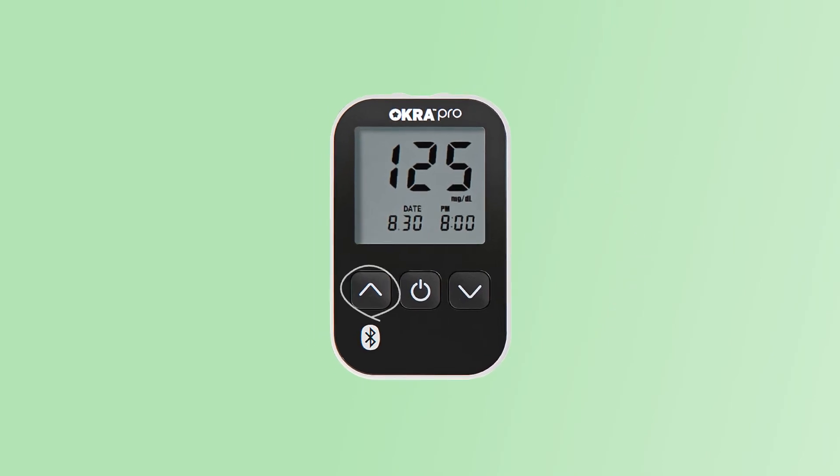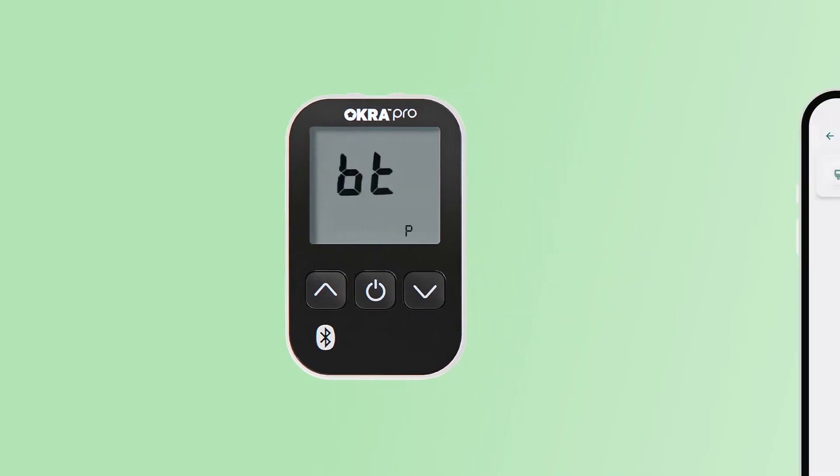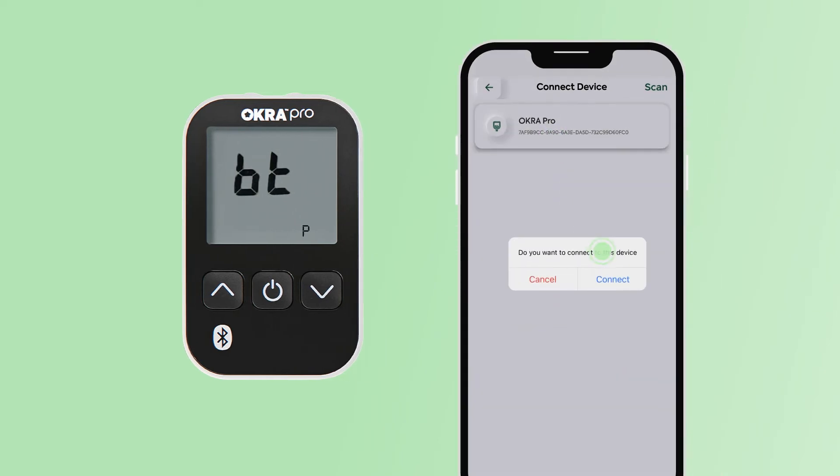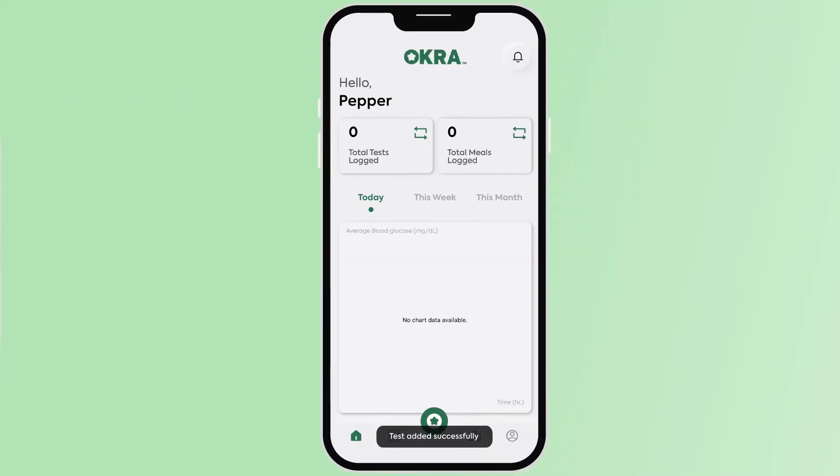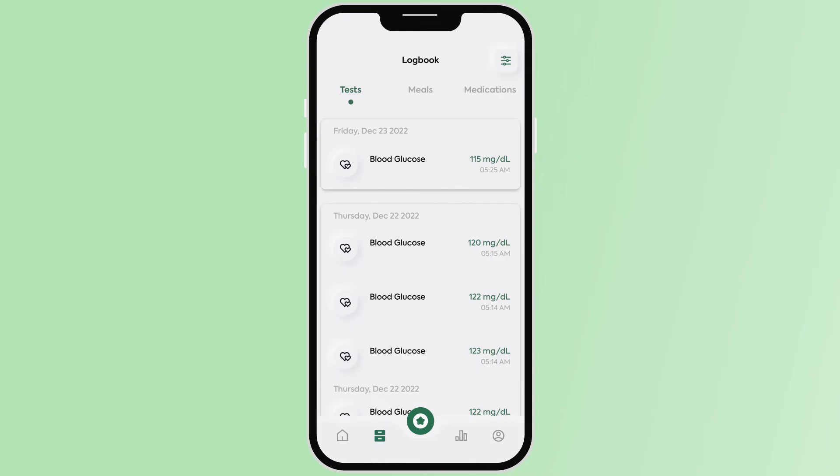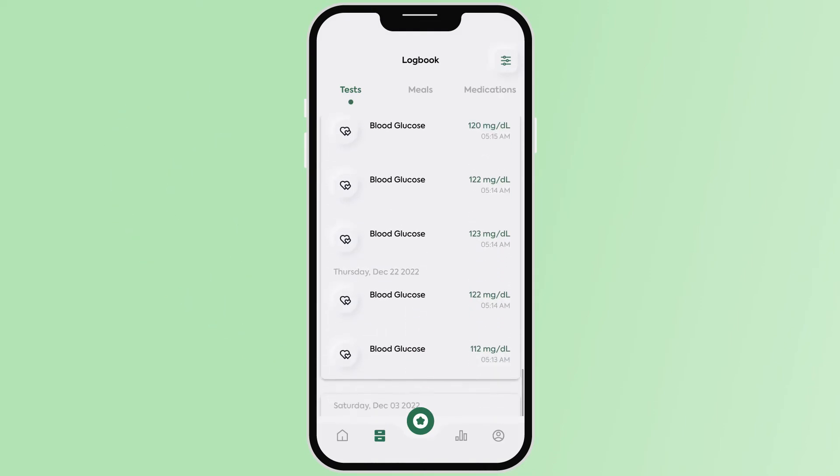Click on the left button on the front for 3 seconds until you see the Bluetooth pairing mode. Find the Okra Pro meter and click connect. Once the device has been connected, return to your logbook to see your latest test results.